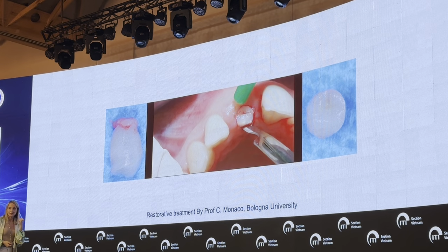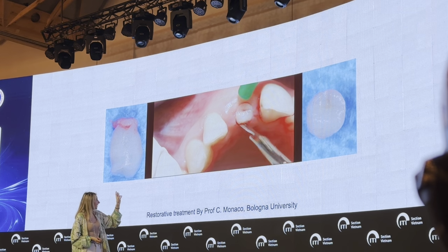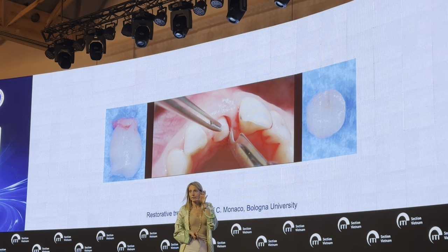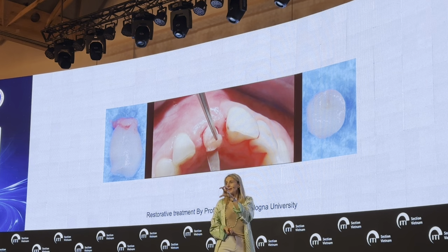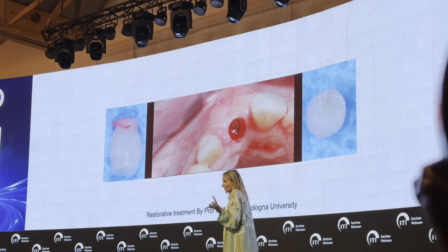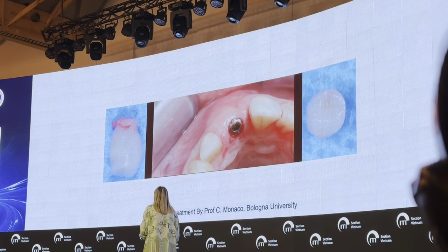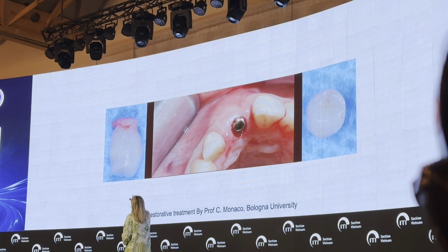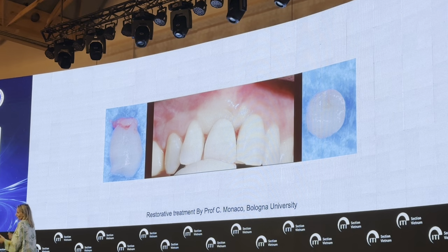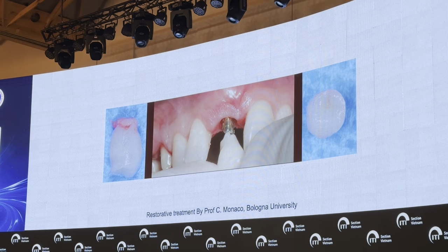planned with the previous scan in order to just remove the soft tissue that are covering the implant head, maintaining untouched the interproximal soft tissue. So once we reach the head of the implant, unfortunately, we have to throw it away. It's a waste of pure collagen-dense connective tissue graft, but we cannot use it in any way.